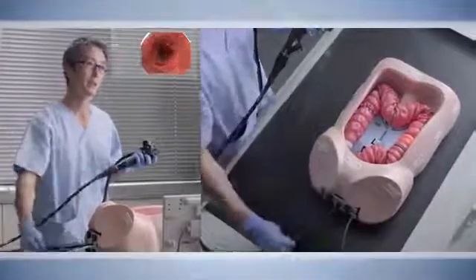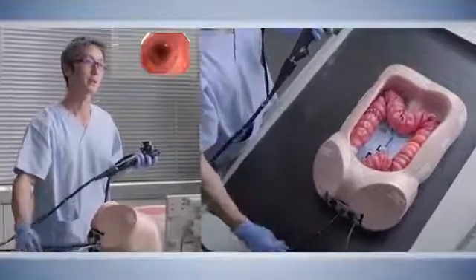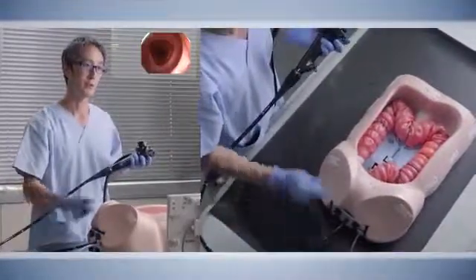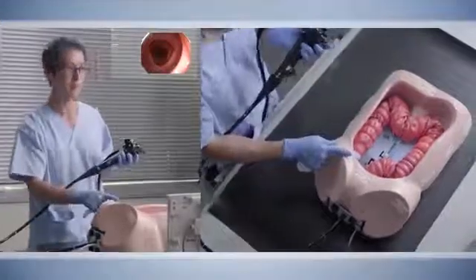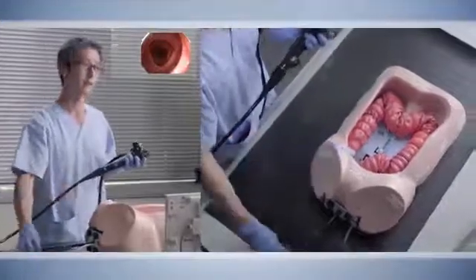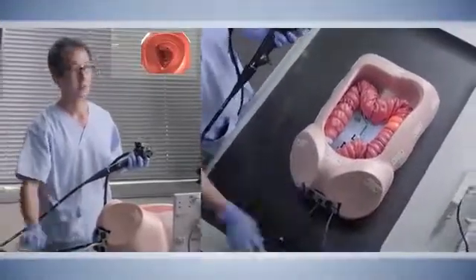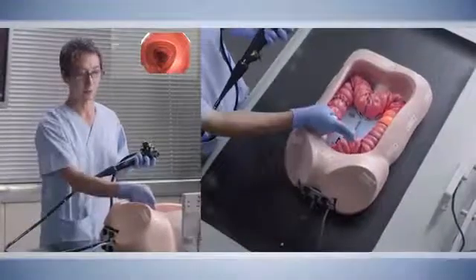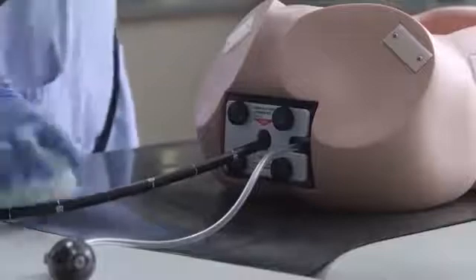As you can see, now the sigmoid colon is straight. You always confirm that you are in the descending colon by this one-to-one movement and also the anatomical features — that you are from 30 to 40 centimeters in the descending colon.